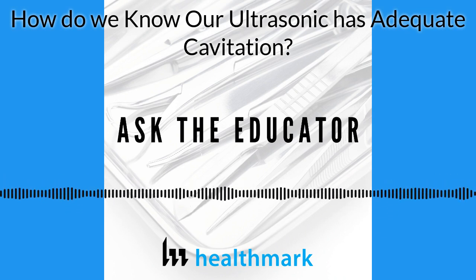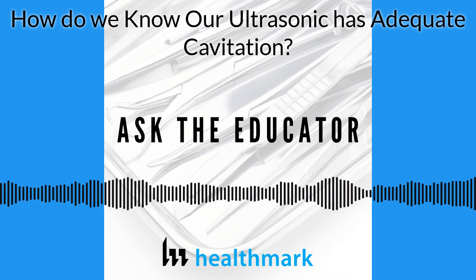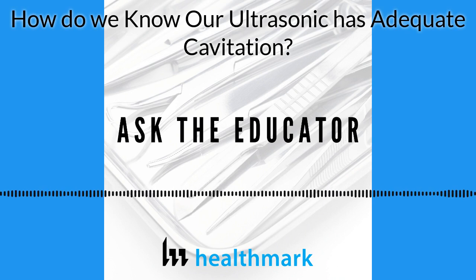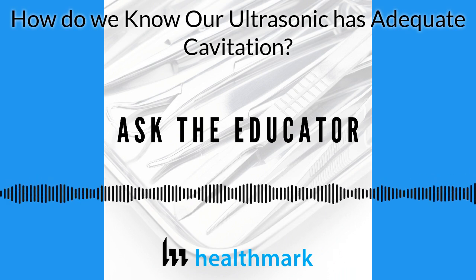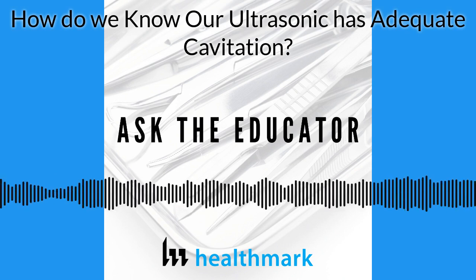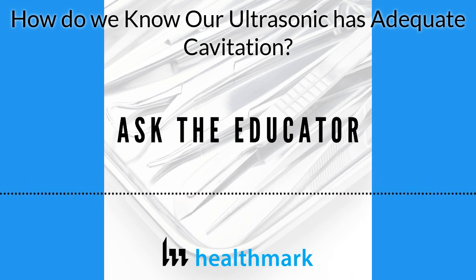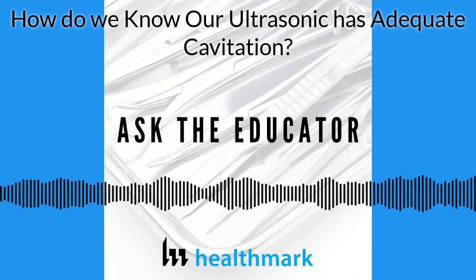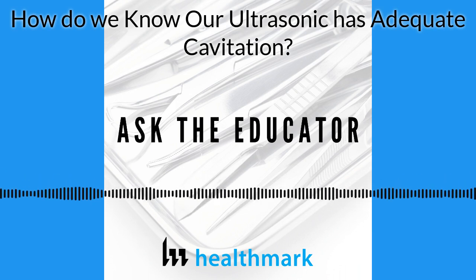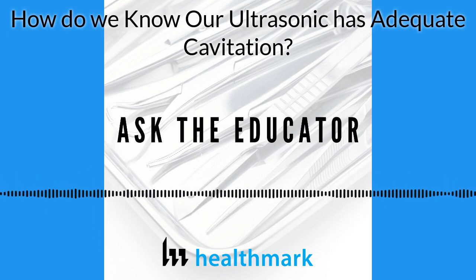It might not pass in the very middle. Why? Because there's too much mass. They didn't spread the instruments out and open them up. So again, part of this gets back to quality management systems and putting in place and knowing what a test tells you when it passes and it fails, and making sure there are clinically relevant and evidence-based products that help you ensure the equipment is performing properly.